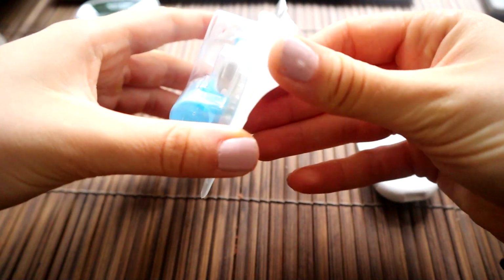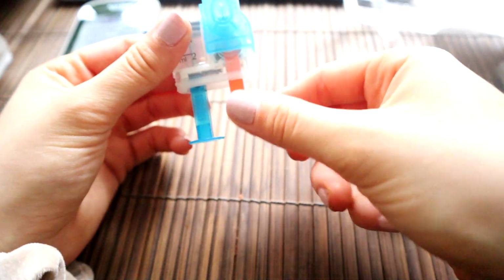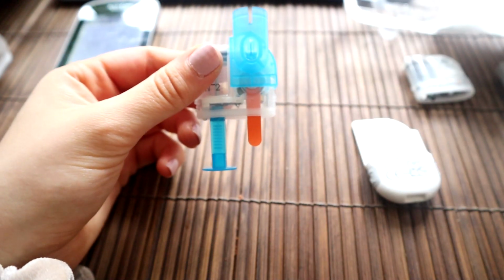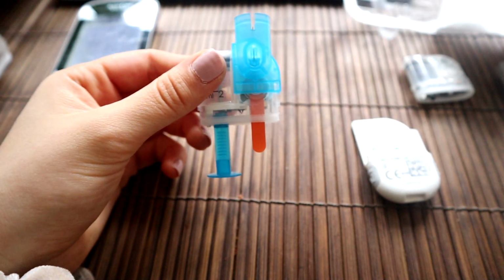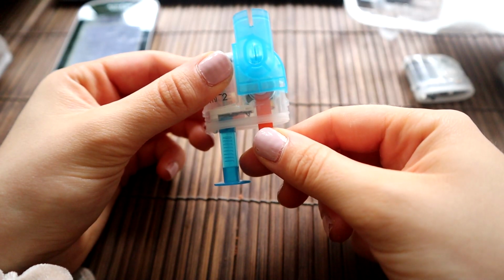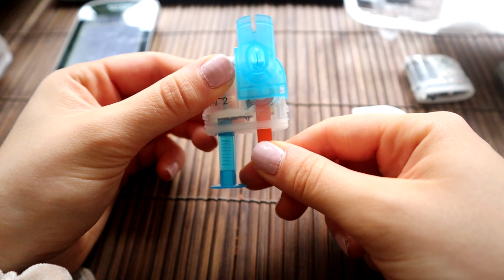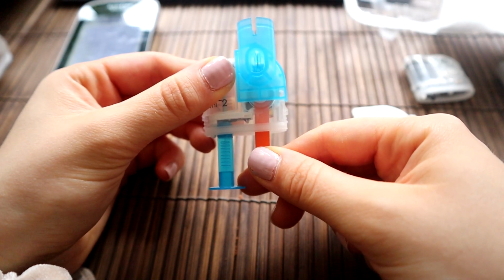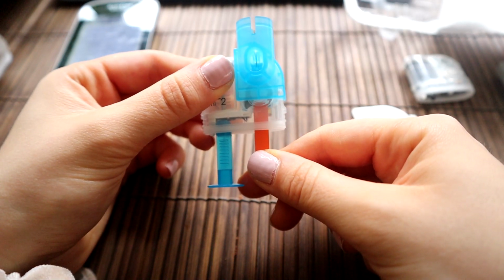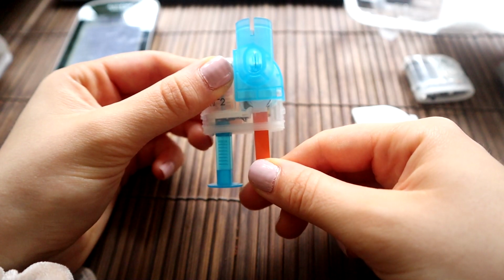So this is the reservoir. We have to take it out of the package. Then this orange tab is covering that zinc battery that I mentioned earlier, and you just have to pull it off. You have to do it really slowly, because if you take it off quickly, it can leave some adhesive on the battery, and then the battery can't get oxygen and it stops working and the reservoir will fail. So yeah, pulling it off super slow.